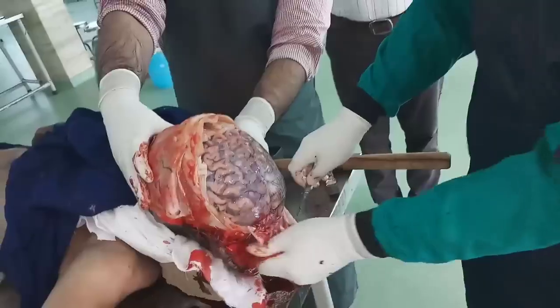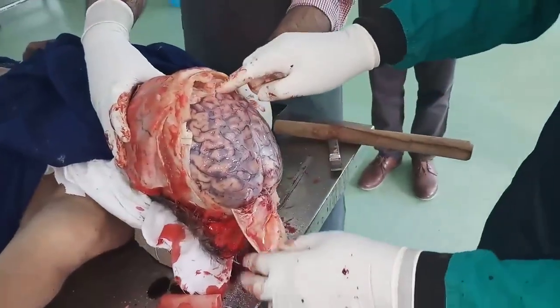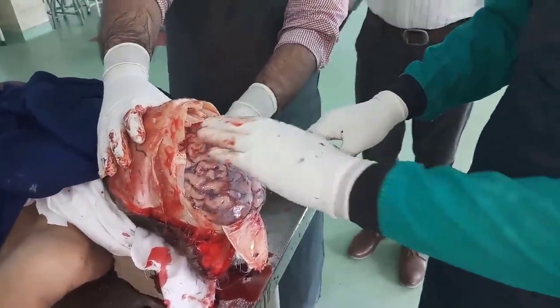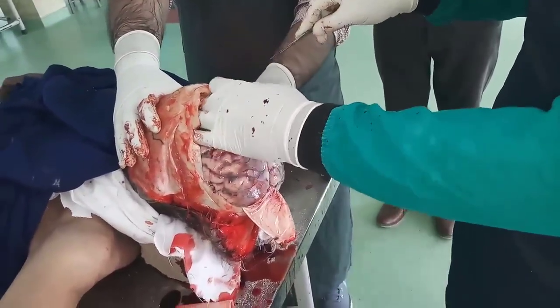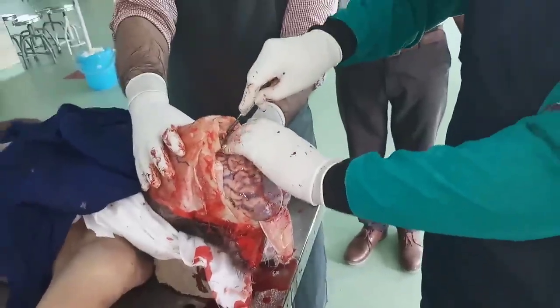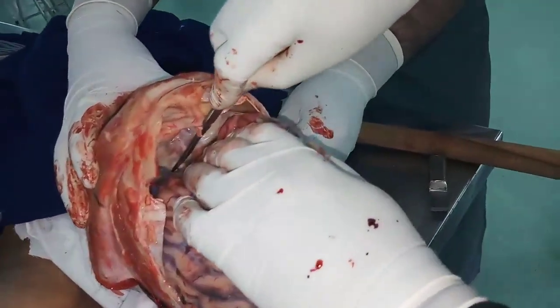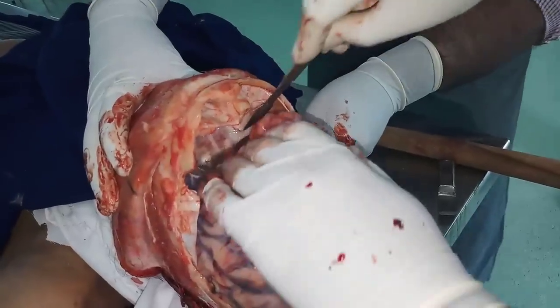You can see the brain. This is the dura. Now we'll remove the brain. We'll just put the fingers of the left hand in front of the frontal lobe. We can see the optic nerve. I'm going to cut this optic nerve. So this optic nerve is cut on this one side and on the other side.